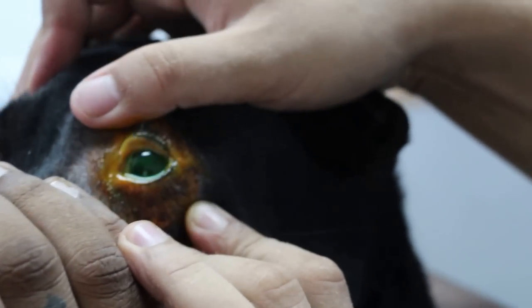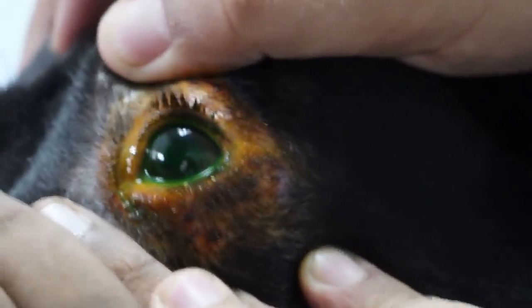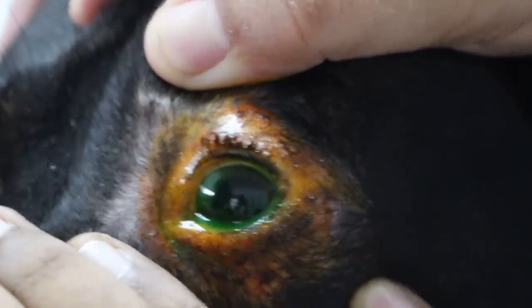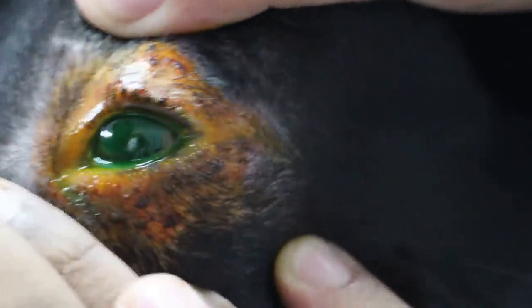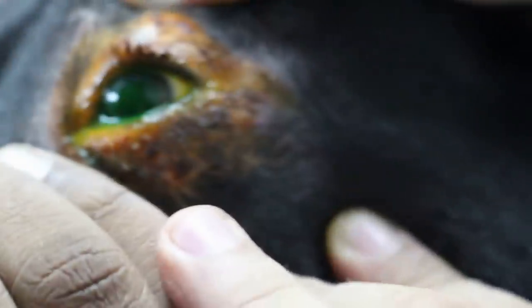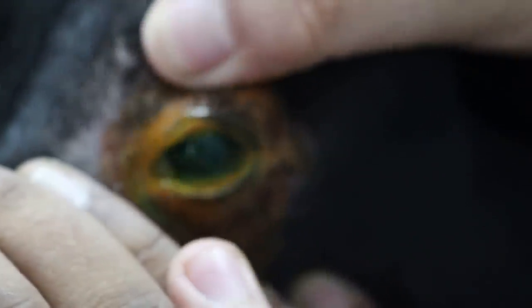So he's been rubbing his eyes, causing the ulcers. Yeah, I can see — keep on scratching the same place. You can see yourself — the green area is on the outside. So I just documented that.